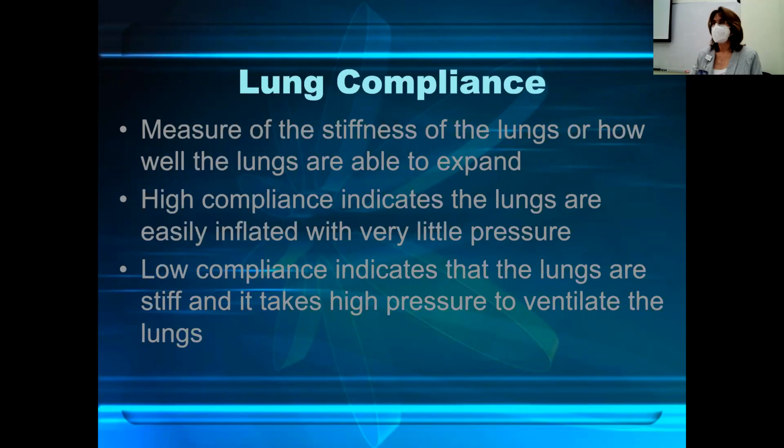If a patient is compliant with their medication, they follow their medication. If somebody has a compliant personality, they just kind of go along with everything. So you can use that definition and it'll help you with understanding lung compliance. High lung compliance, very easy to ventilate, very stretchy. So easily inflated with very little pressure. That's high compliance.